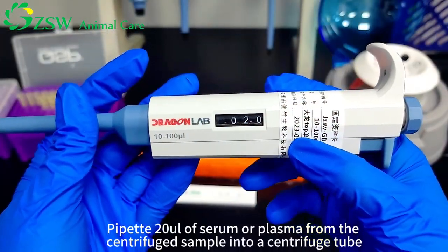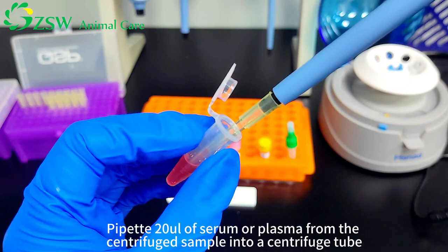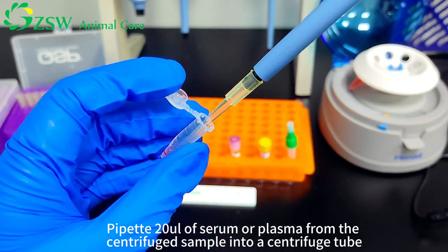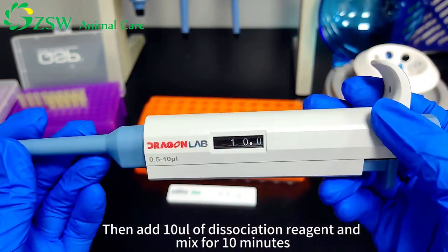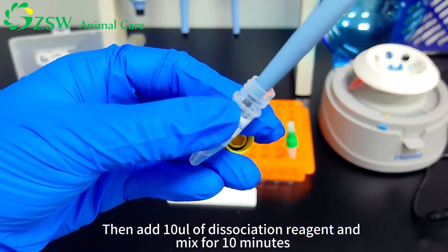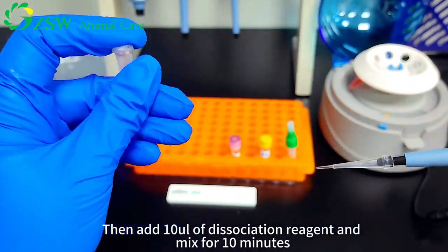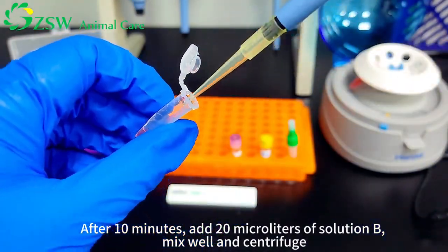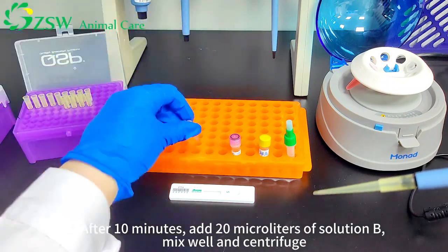Pipette 20 microliters of serum or plasma from the centrifuge sample into a centrifuge tube. Then add 10 microliters of dissociation reagent and mix for 10 minutes. After 10 minutes, add 20 microliters of solution B, mix well, and centrifuge.